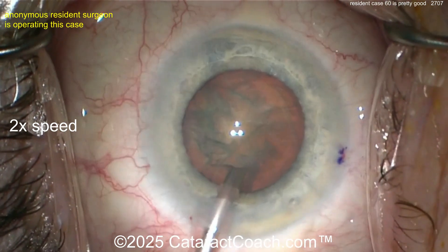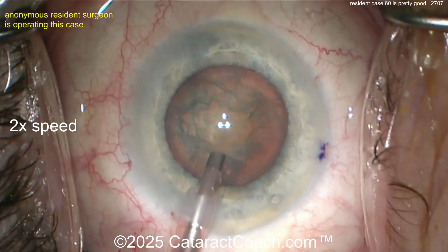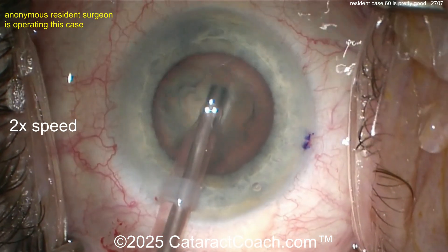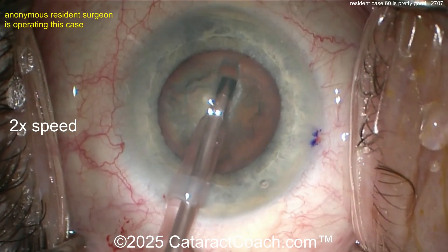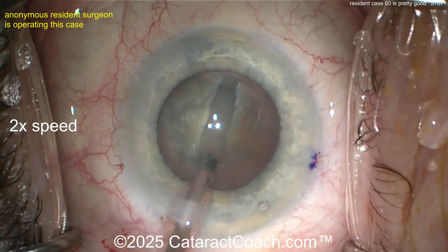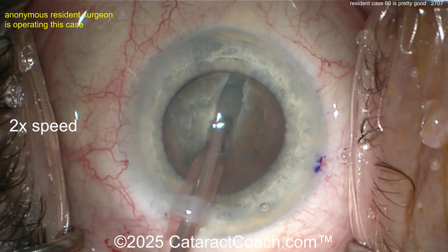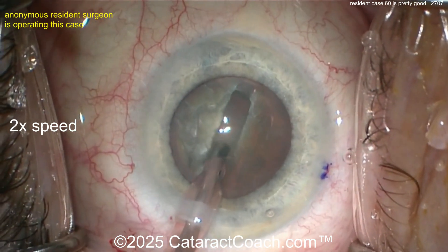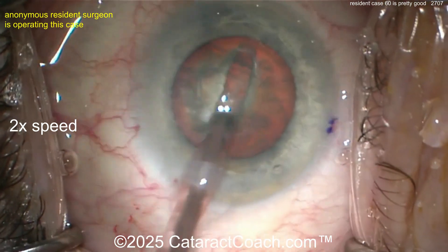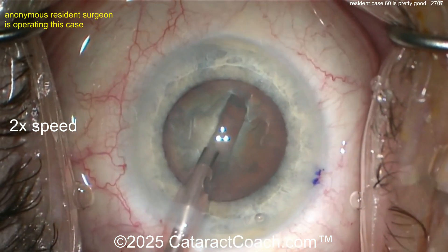I can see that you have an attending or consultant helping you with surgery — that looks great. Taking out some of the anterior cortical material, and let's see — going to do a groove down the middle. Perhaps you're going to impress us with a stop and chop. Here's one groove, there you go — another groove, keep it going. Remember the lens is shaped like an M&M candy, so it's thicker in the middle, thinner in the periphery. A little bit deeper in the middle — looking good, very nicely done. Maybe widen up the groove a little bit — I find that helpful — but you don't have to.